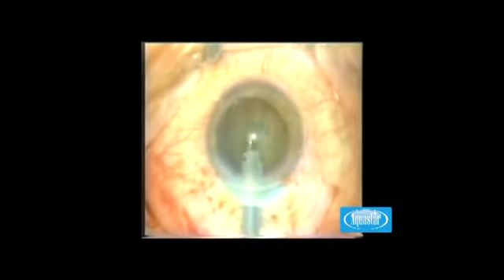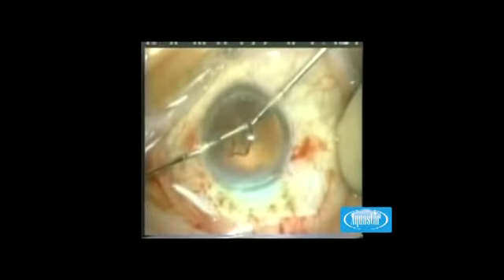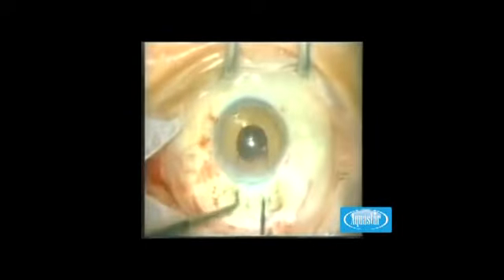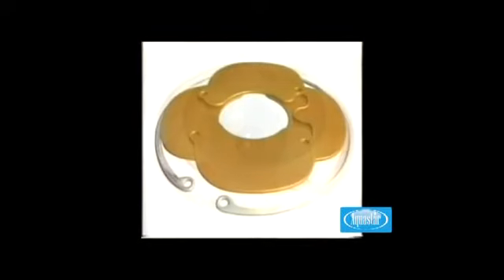With a stabilized capsular bag, the capsular tension ring permits emulsification of the lens nucleus and targeted aspiration of the cortex. After endocapsular implantation of the posterior chamber lens, the two IPS double elements are implanted to create an artificial pupil. Despite the zonulolysis and the implantation of 4 endocapsular prostheses, the result is a stable situation in the capsular bag.